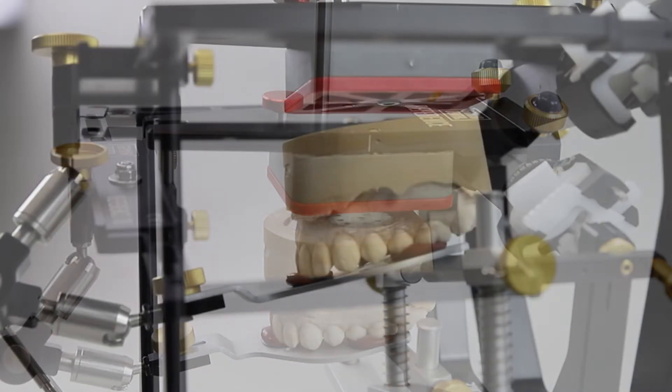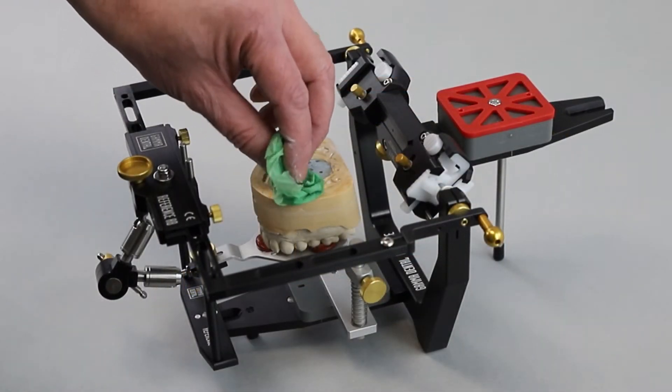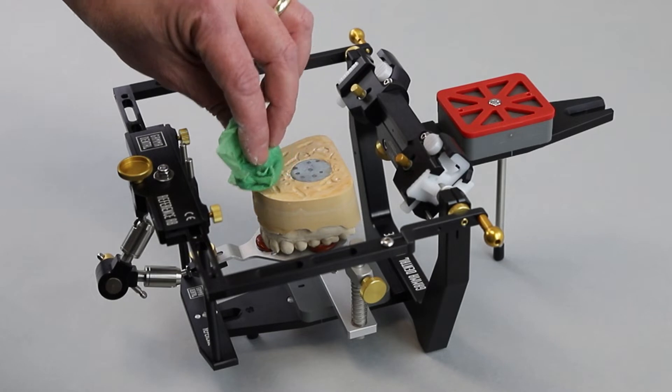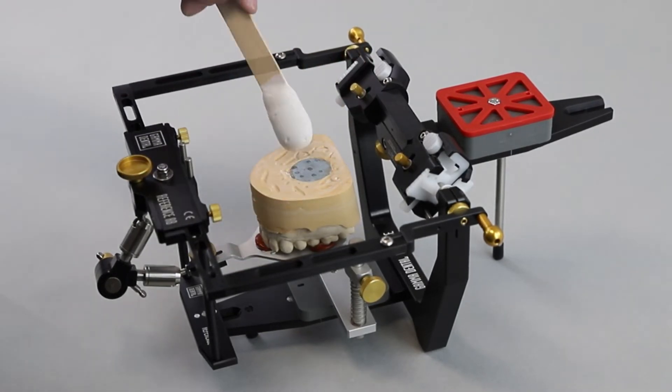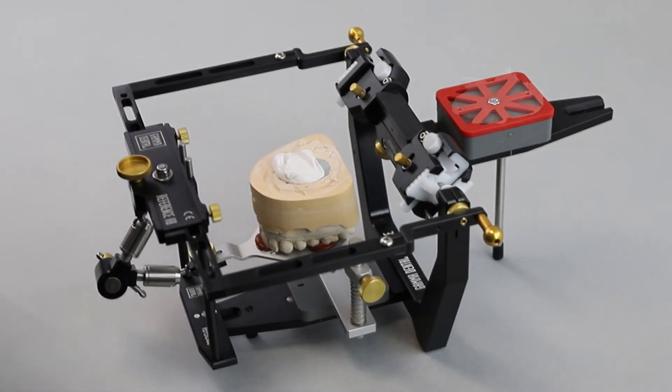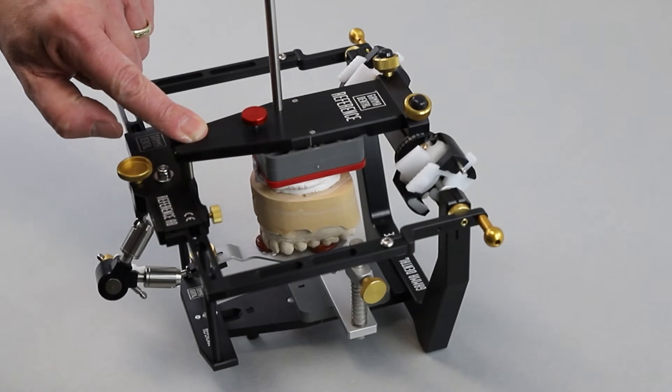This will minimize the distortion effects of plaster expansion. Moisten the model and apply the mounting plaster to the model and the mounting plate, then close the articulator. Allow the plaster to harden according to the manufacturer's instructions.